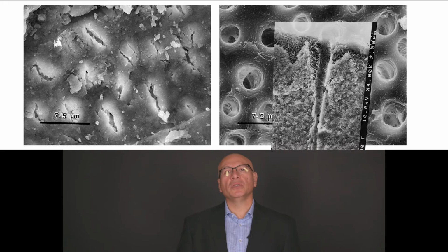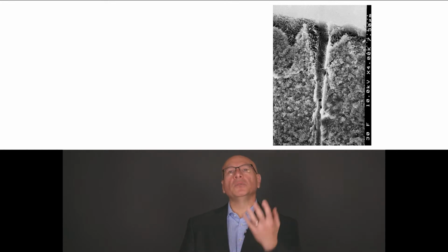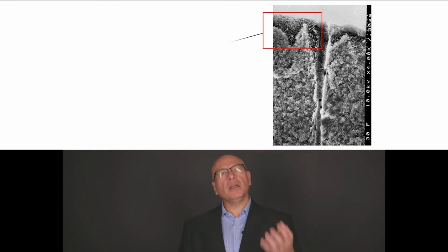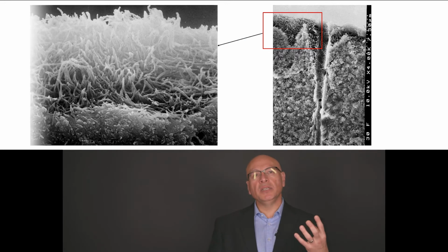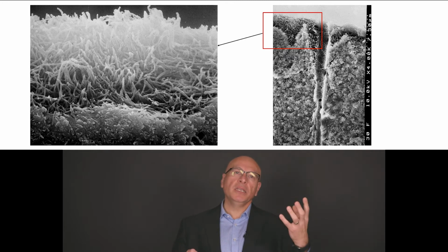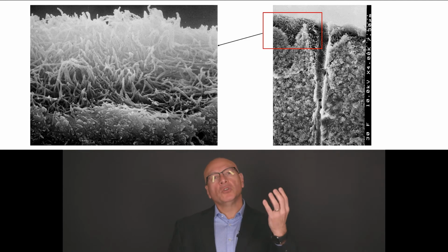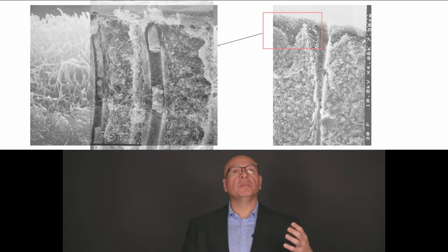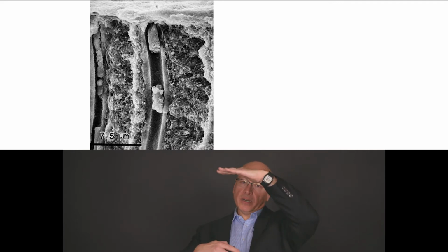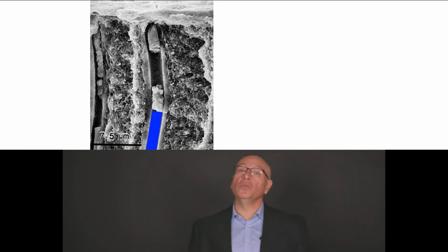If I show you a cross-section, you see that now pulpal fluid will come through the pulp and makes it much harder to bond to. At a higher magnification, you'll see what is left behind after you etch, this sponge, okay? And this sponge is kind of floating in the water after the etching. So if you etch for very long periods of time, this is going to be very different. The depth of demineralization is much greater the longer you etch. So it's much more difficult to replace what you remove.